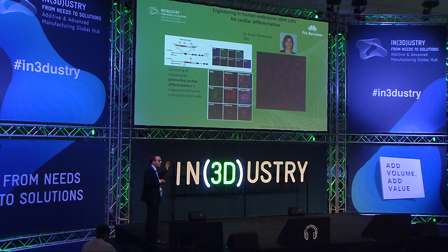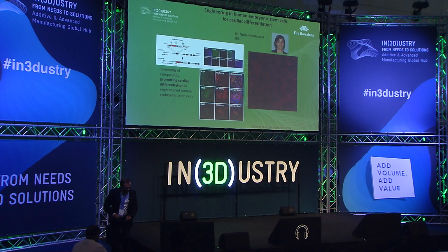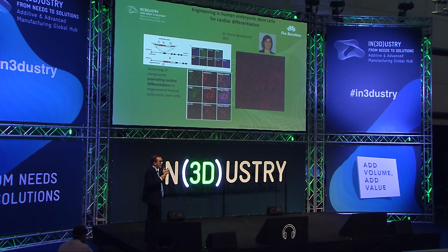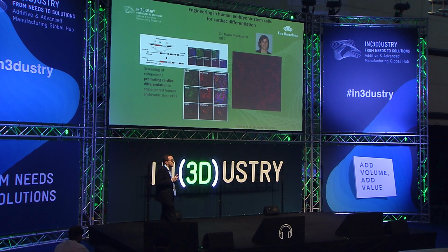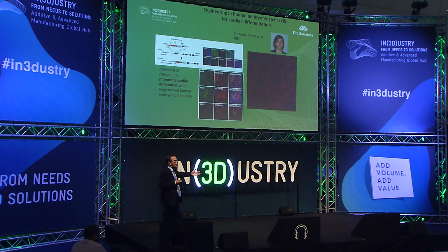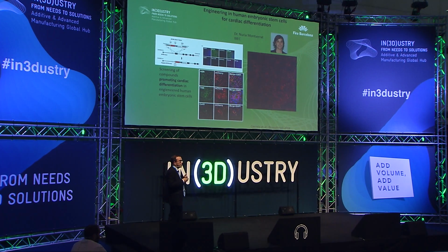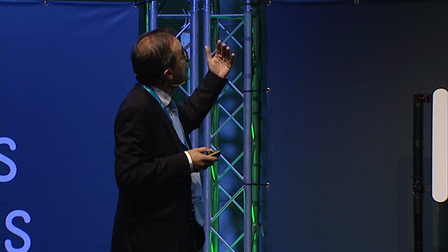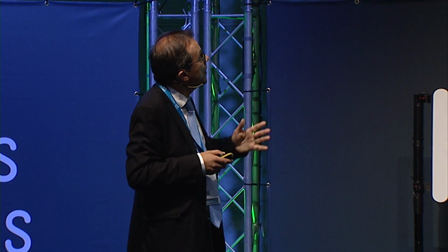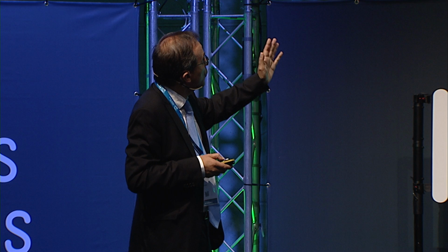And I will try in the next slides to show some of the contributions that at this moment we are working on. So, for instance, one of the first questions in 3D bioprinting is to develop the cells, and in this case, the iPS, and the evolution of the iPS and the differentiation of iPS is essential. For instance, in the case of cardiac tissue, you try to develop a 3D cardiac tissue. One option is to use first human embryonic stem cells in order to produce the cardiac differentiation. In this case, Dr. Nuria Montserrat is our team leader in our institute to produce that.